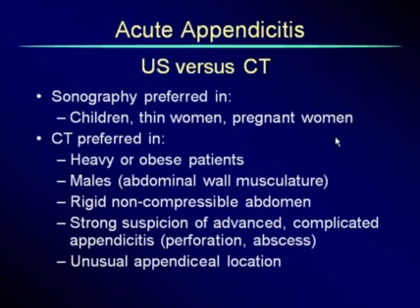Sonography is preferred in children because of the radiation, in thin women because it's easier to get at the appendix, and in pregnant women. This is where we should start. We should start with ultrasound.